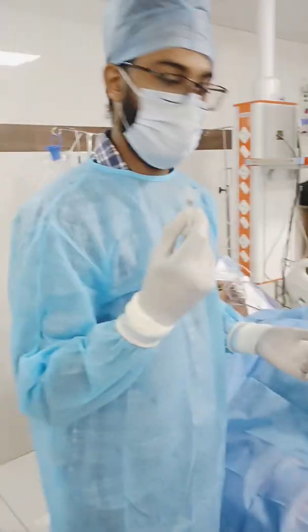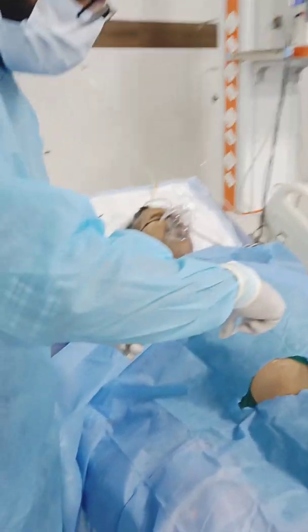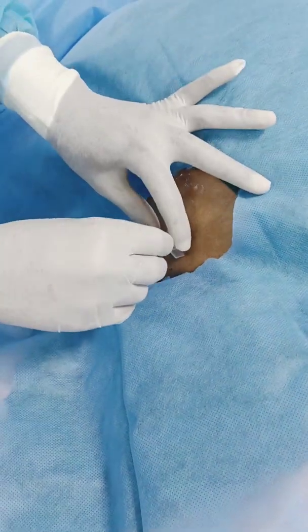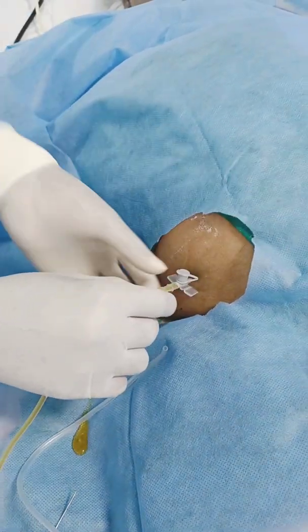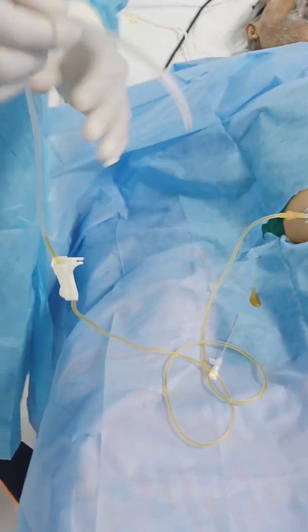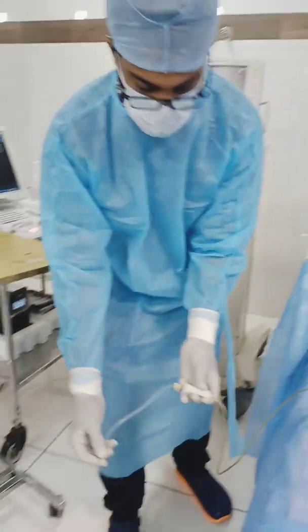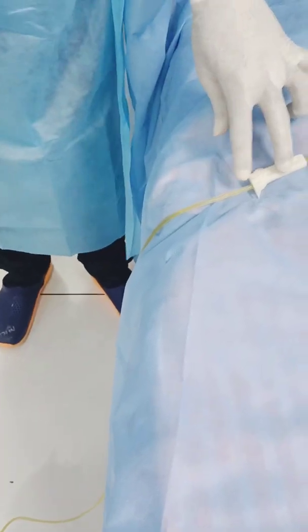The first part, the diagnostic tapping, has been completed. Now moving into the second part — that is therapeutic paracentesis. Using a 16-gauge cannula, I am inserting into the abdominal cavity and removing the stylet. There you can see the ascitic fluid is draining. Connect the IV set into the cannula and collect the fluid into a jar.